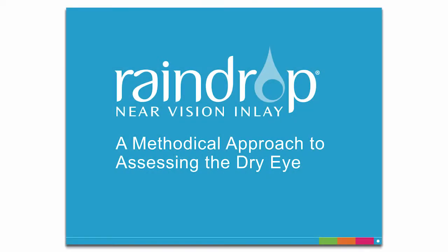A methodical approach to assessing the dry eye. Assessing the dry eye for potential Raindrop Near Vision Inlay candidates is a crucial step in patient selection. In this video, you will learn an easy method for assessing dry eye.